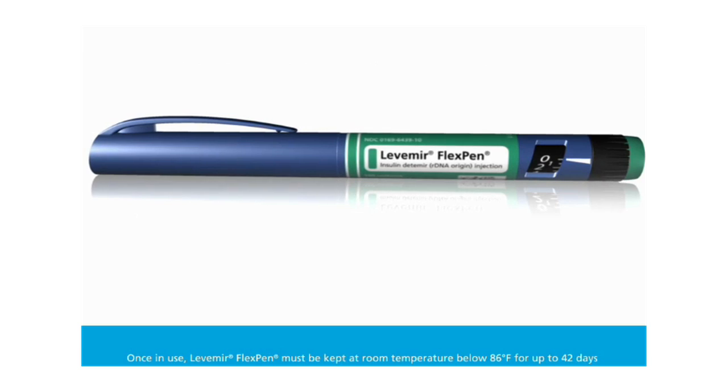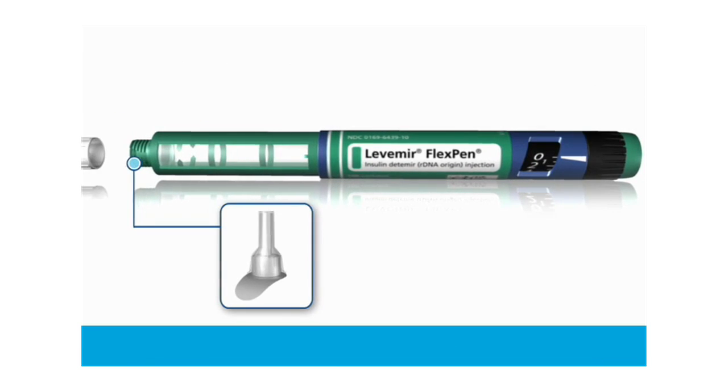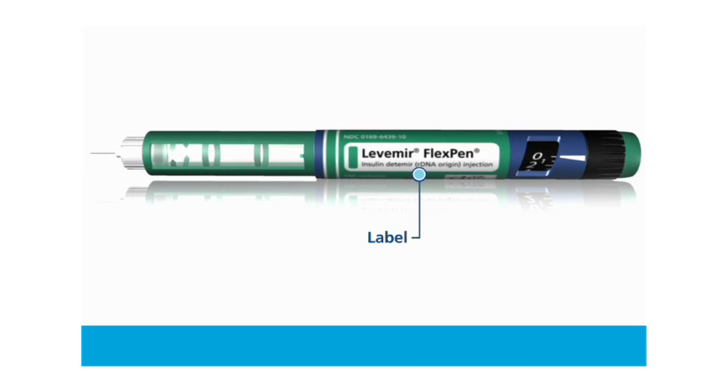Before you start to prepare your injection, make sure you have the correct insulin brand FlexPen, a Novo Fine needle, and an alcohol swab. Check the label to make sure that you are taking the right type of insulin. This is especially important if you take more than one type of insulin.